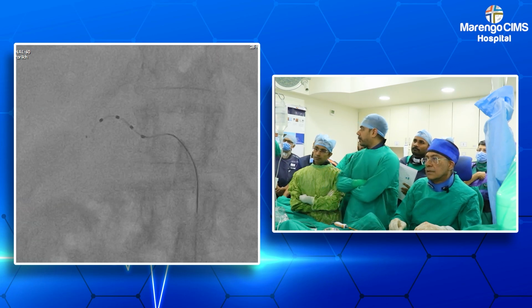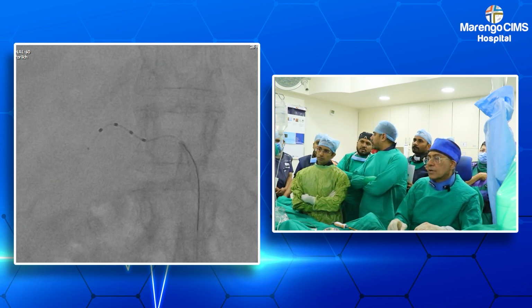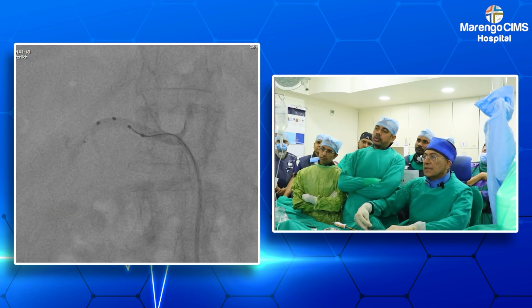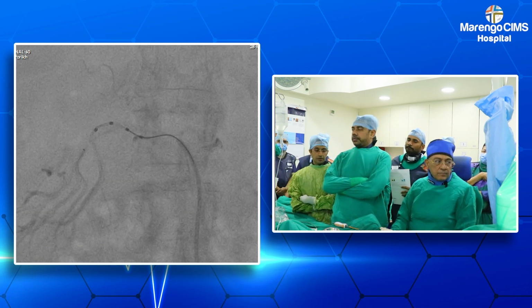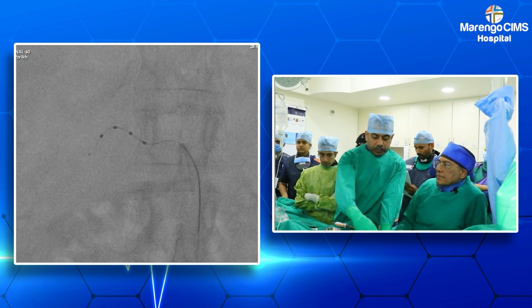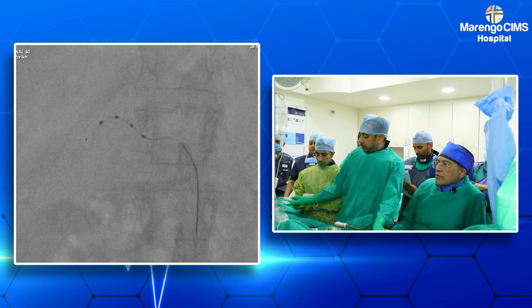We have the road map here. We can show the road map. Record. We just come back. ACT. While Dr. Tejas is flushing the system, ACT is adequate.